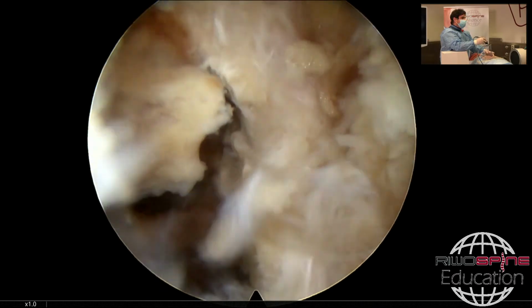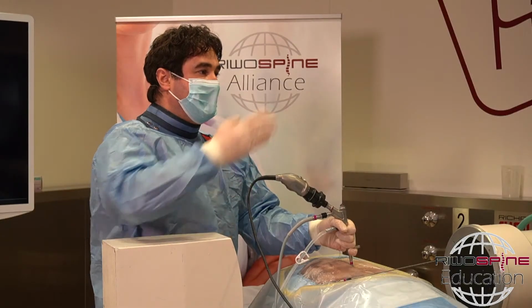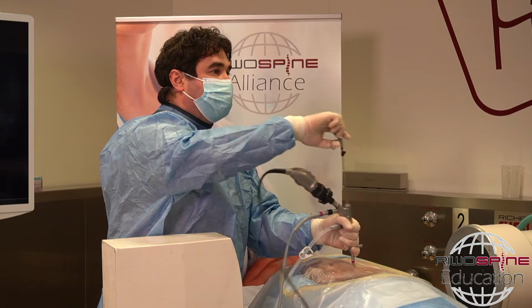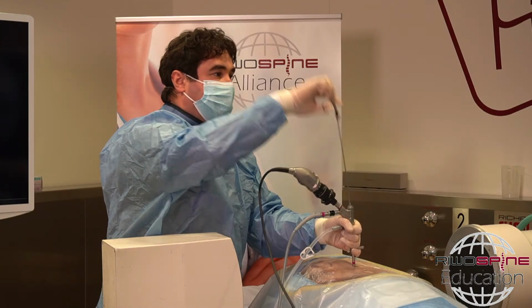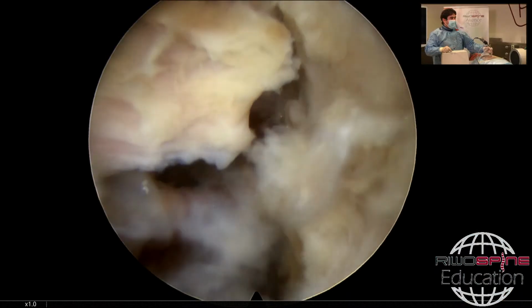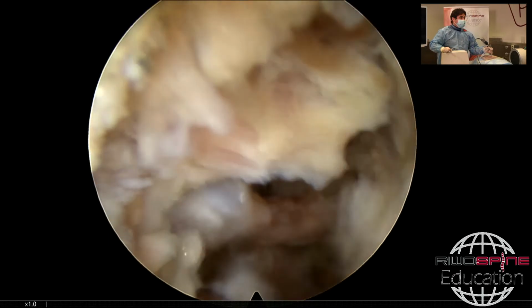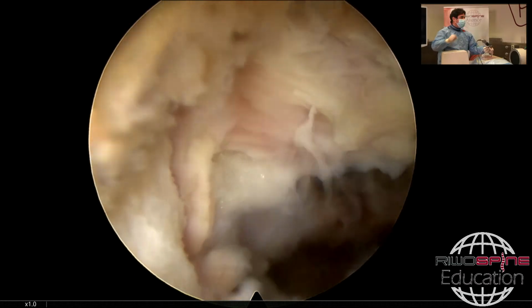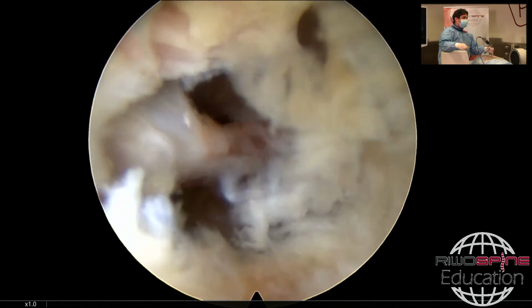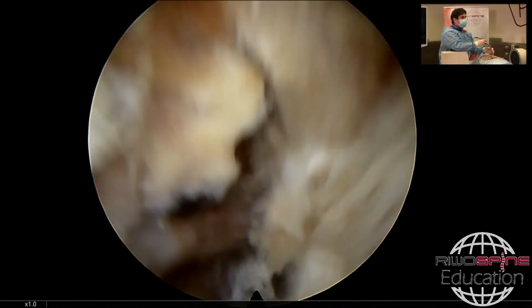Of course, I presented you the first without bone drilling that we can reach. In this case, you wouldn't have this defect on the ligamentum flavum. You have only one incision, not more than 2 or 3 millimeters, and by stretching the ligamentum flavum, we can easily reach there. And also, if I would prefer the bone resection first, then I could do bone resection first, and then open the ligamentum flavum from here to here again to have a smaller defect. I think this is the technique to reach the far caudal migrated disc herniations.